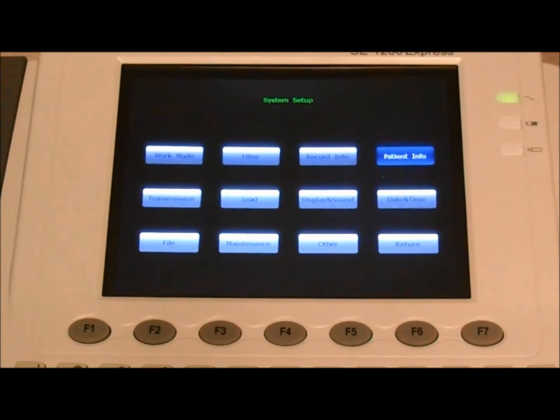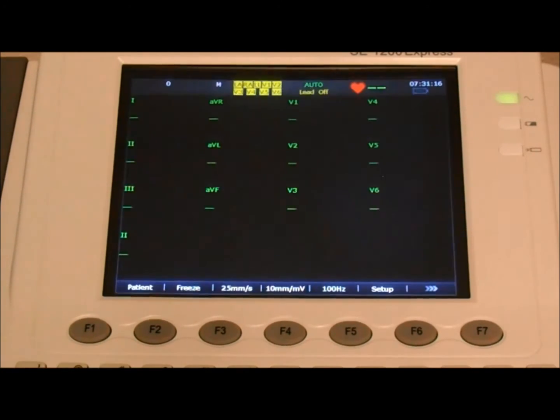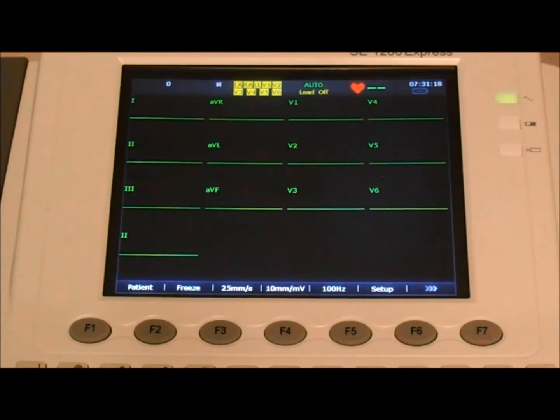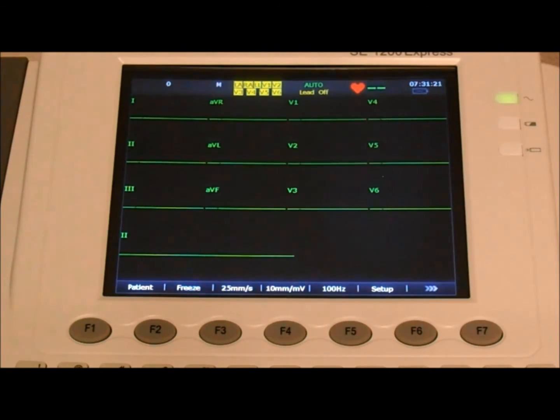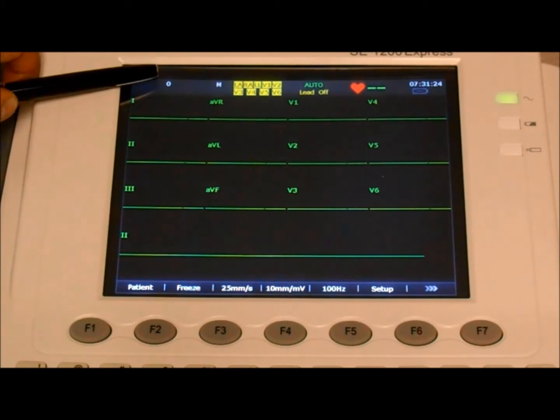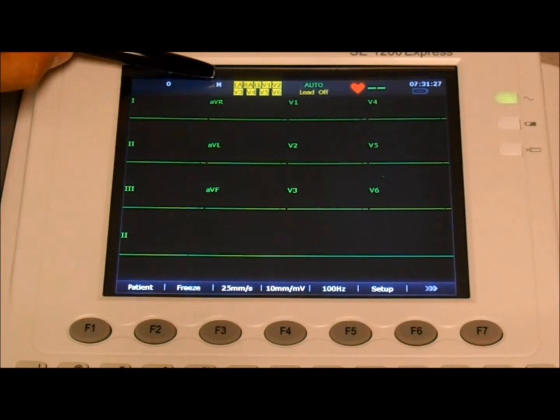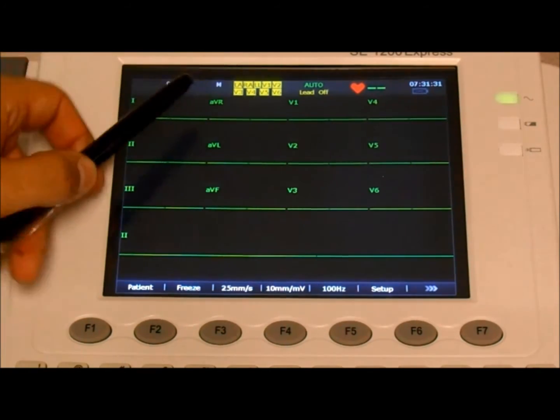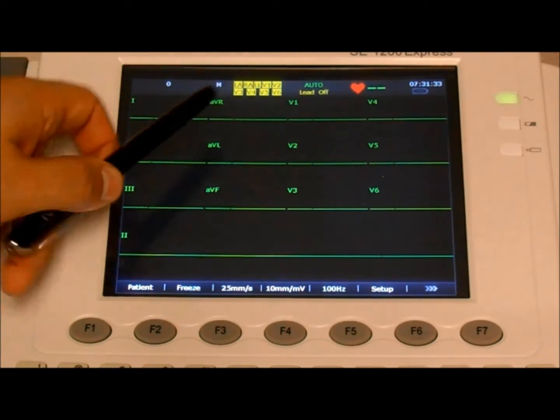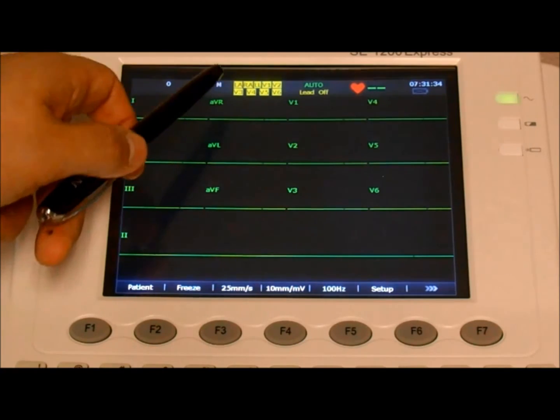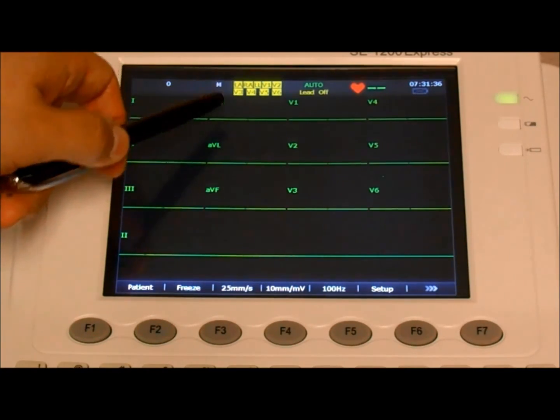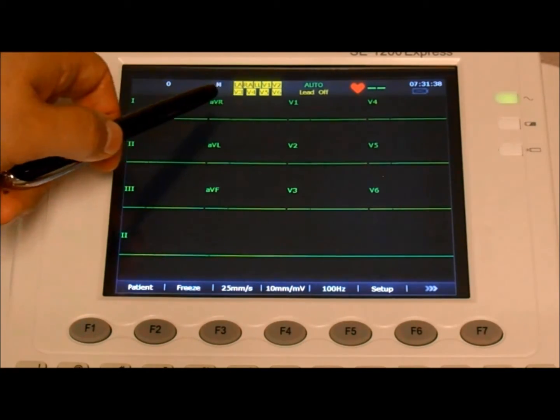And now we're ready to do an actual examination. So we're back in the user interface. And to give you an introduction of the different sections, up here we have the patient ID, the patient sex, and this is the lead information.